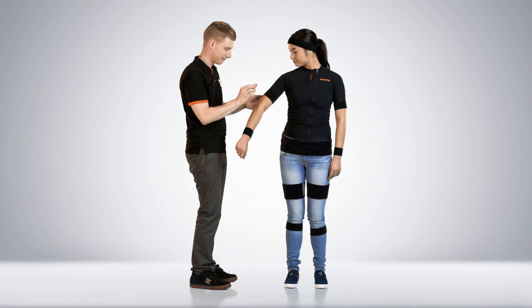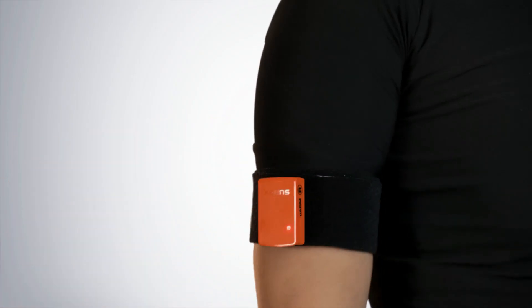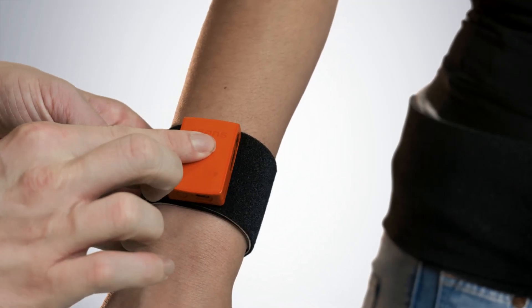Place the motion tracker on the flat surface of the upper arm. The lower arm motion tracker needs to be placed on top, just above the wrist.